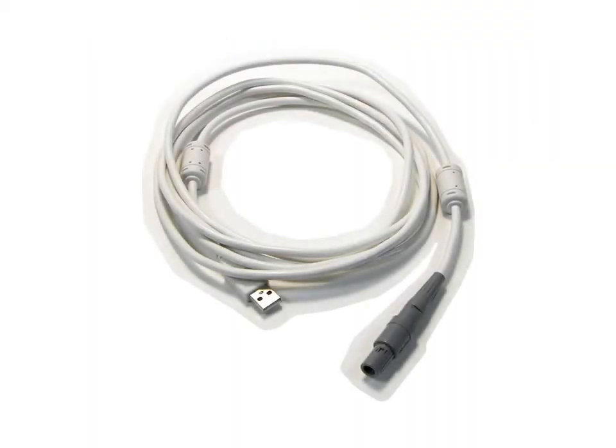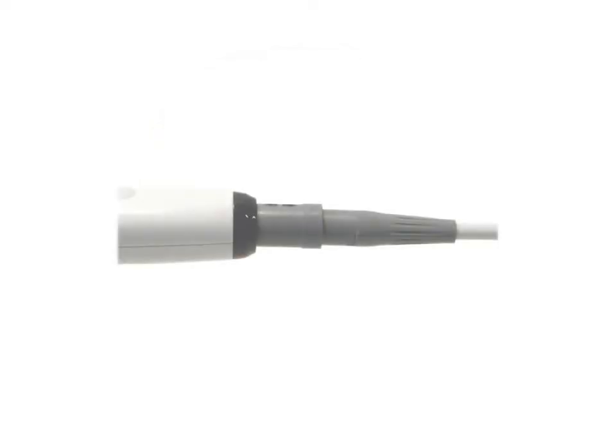The USB cable is designed specifically for use with the camera. It provides power for the camera's electronics and a path for data transfer between the camera and the computer. Attach the cable by inserting the plug into the camera. Remove the cable by gently pulling on the plug.